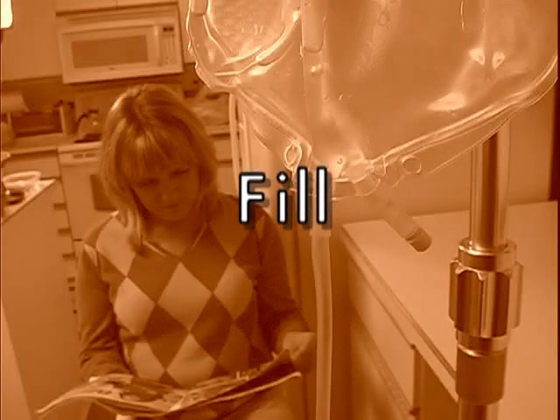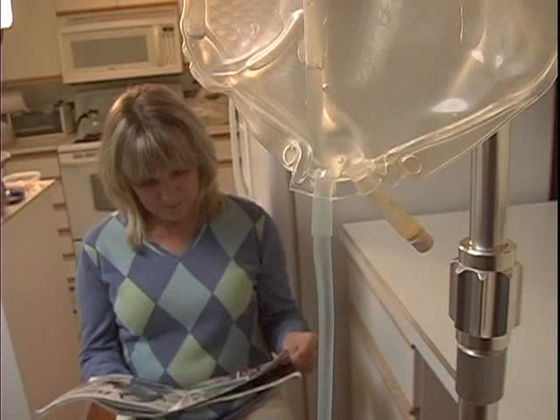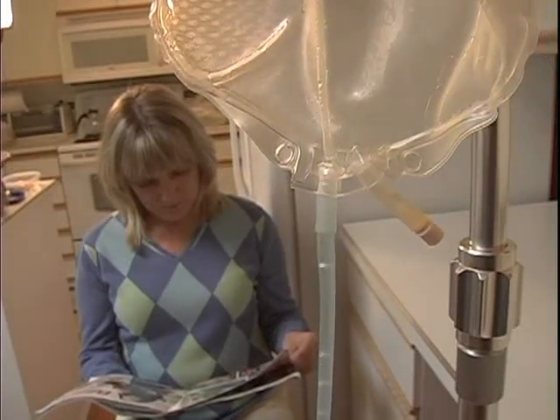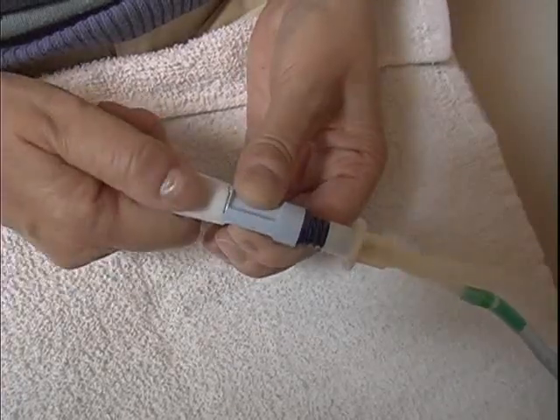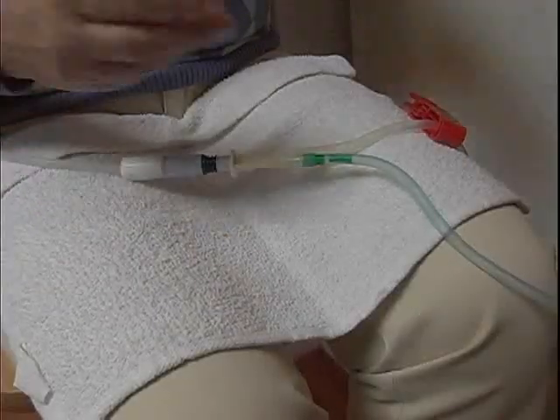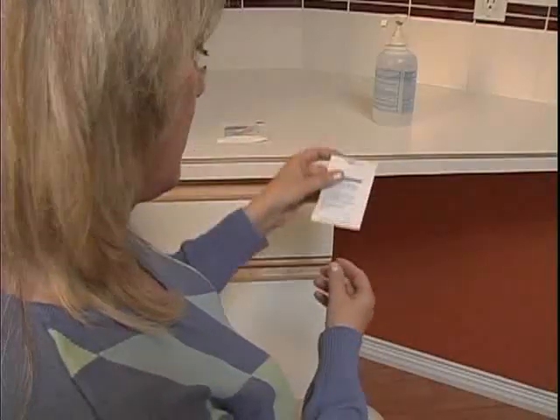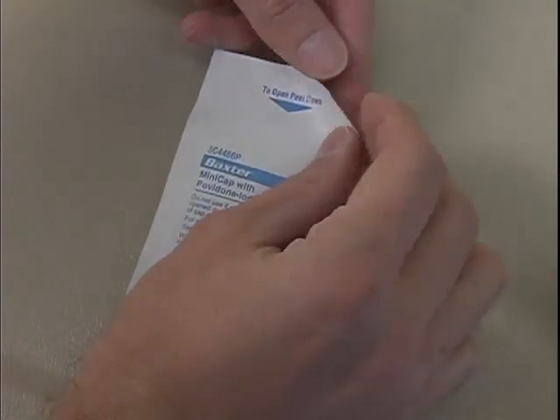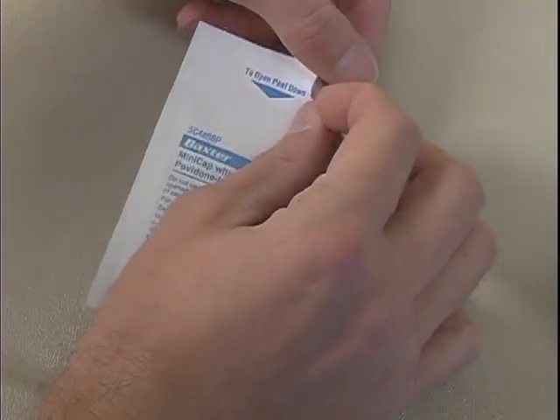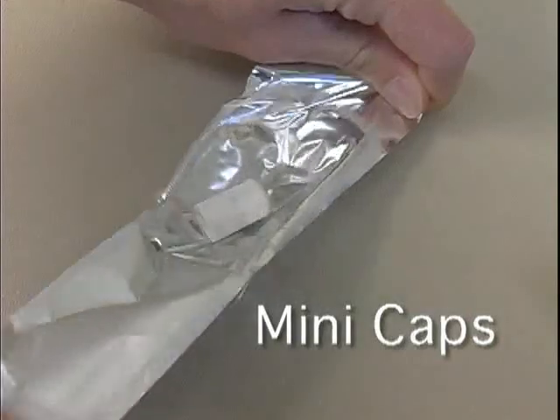Open the transfer set twist clamp to fill. This takes approximately 8 to 10 minutes. When full, close the transfer set twist clamp and ensure that it has clicked into place. Place the second red clamp on the fill line somewhere below the level of the hanging fluid bag. Check the expiry date of the new mini caps. Open the mini cap package by placing it foil side down on your supply surface. Peel back the packaging and expose the mini cap.